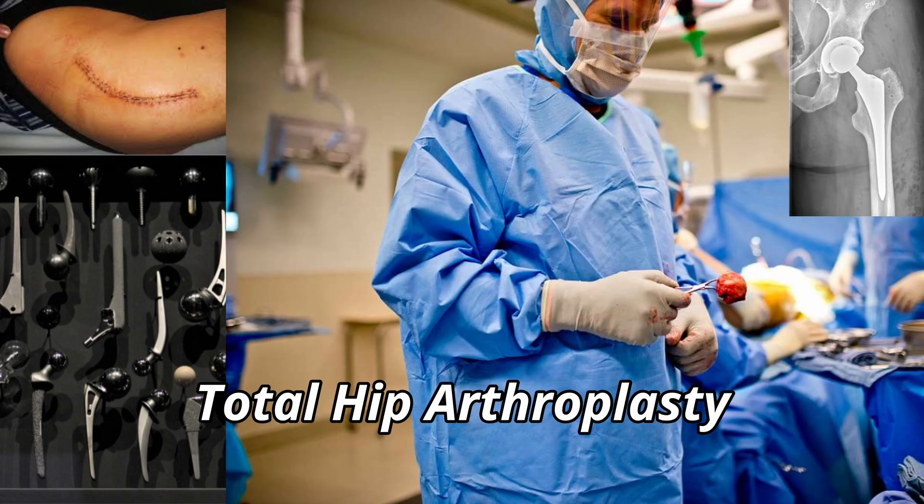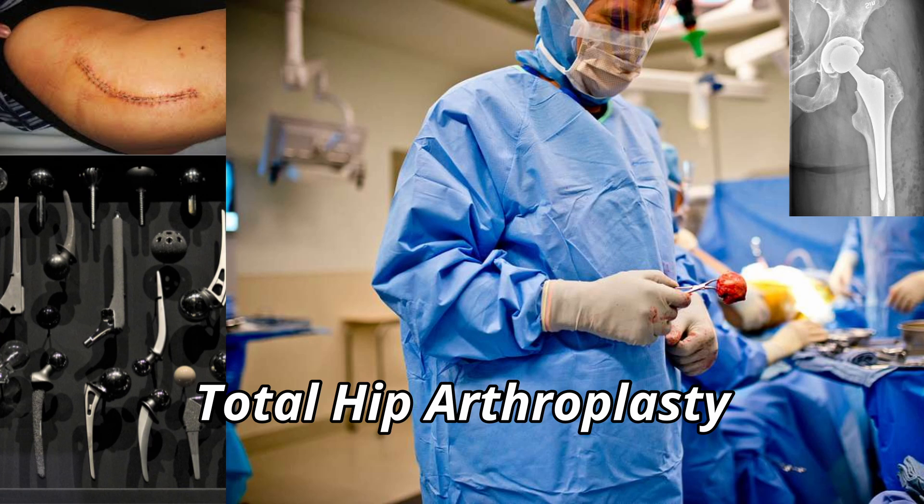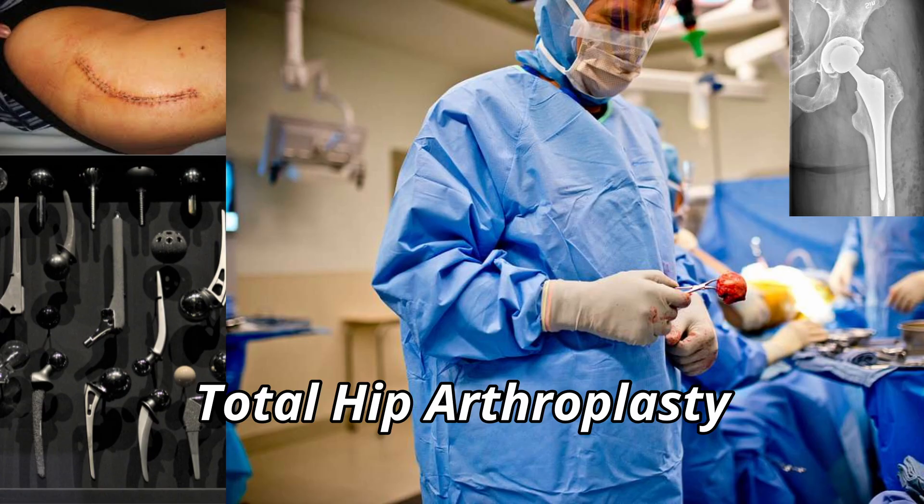Step 3: Capsulotomy and Femoral Head Dislocation. The posterior capsule is incised in a T or H-shaped pattern with Metzenbaum scissors. The hip is internally rotated and adducted to allow posterior dislocation of the femoral head using a bone hook and hip skid. Pearl: Internal rotation and controlled traction aid in smooth dislocation without excessive force. Avoid sudden movements that could damage surrounding soft tissue. Once dislocated, the femoral neck is cut using an oscillating saw, guided by preoperative templating and intraoperative measurement.